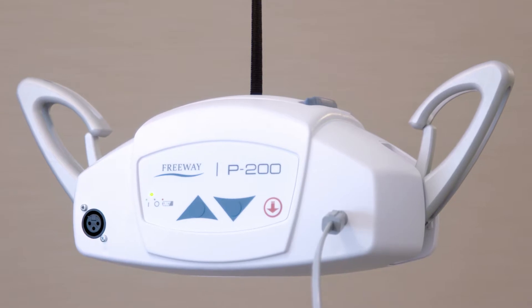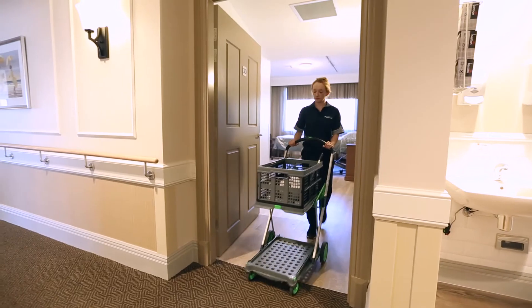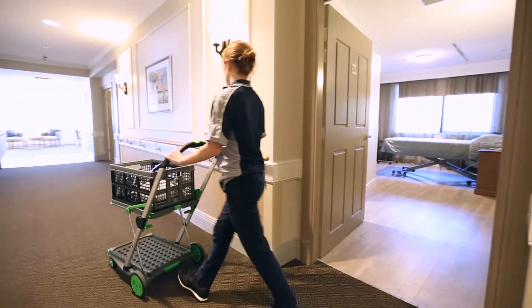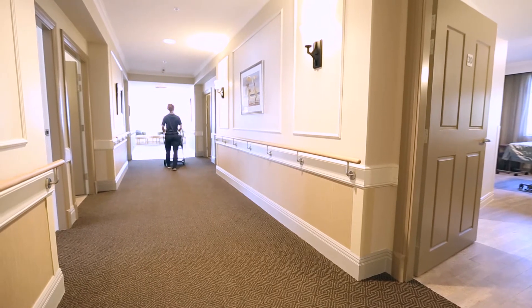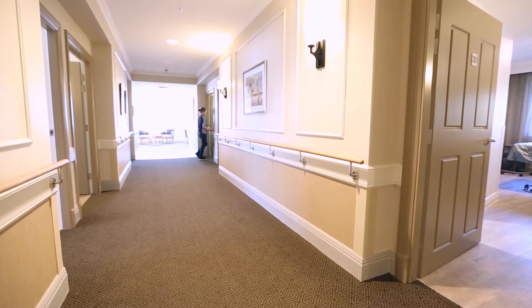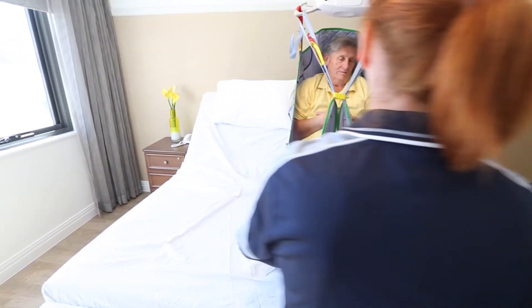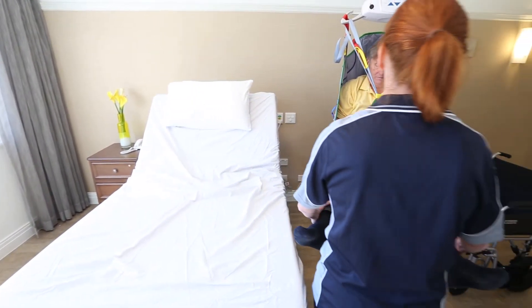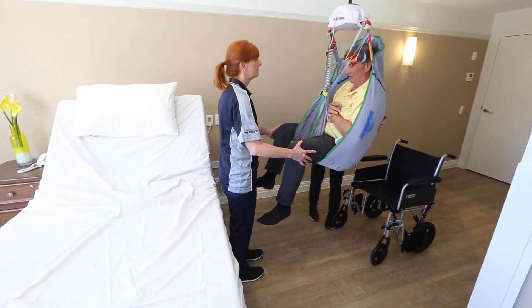The P200 does not take up valuable floor space in a resident's room. Not only that, it can serve multiple track systems, saving significant costs for a facility fit out compared to a permanently fitted hoist. Using the P200 ceiling hoist allows caregivers to move residents with minimal physical effort, providing a safe working environment in which residents and caregivers are protected.